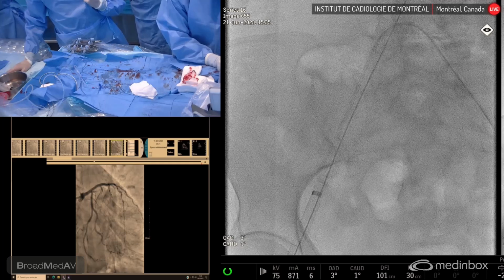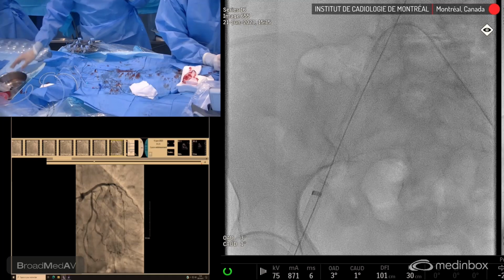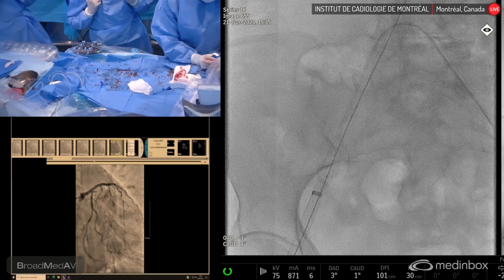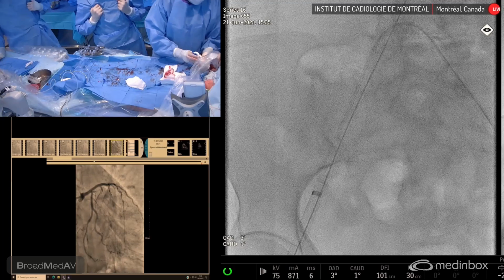Okay, so I'm at 10, 9, 8. Do you see me? Yeah. Oh, you see the wire? 7, 6, 5. Anchors are open. Okay.